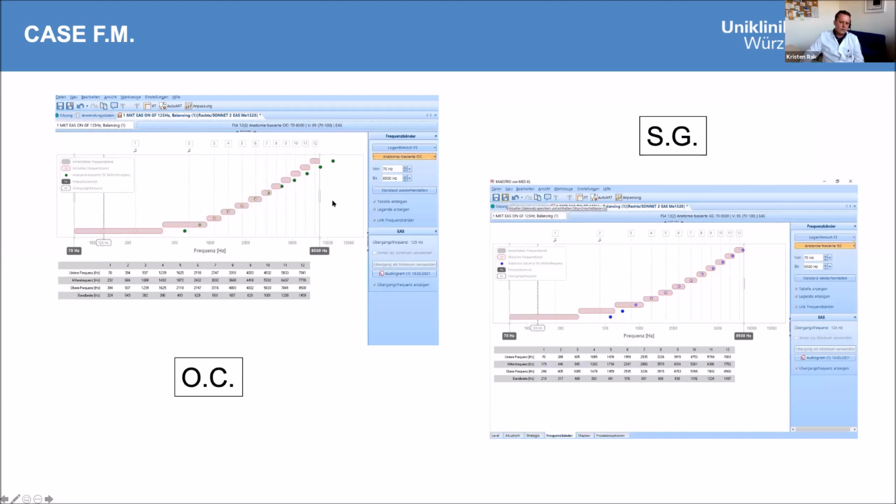At the moment we are working on how we should use these contacts, which are out of the range of the fitting of the Maestro software, which is about 8.5 kilohertz, with the spiral ganglion as a calculation that fits much better. And we have 2 studies at the moment where we want to investigate this too.